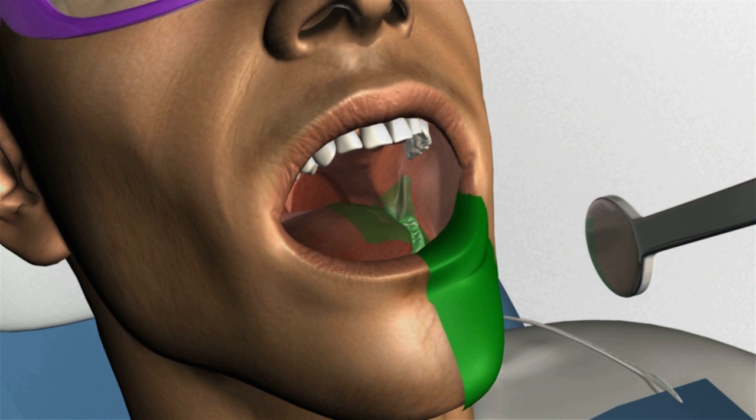Finally, to test whether you've achieved the appropriate areas and depth of anesthesia, ask the patient where he or she is numb by stroking the mucosa or tongue with the back of your explorer. Compare this to the normal contralateral side.